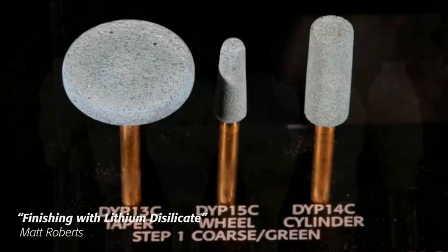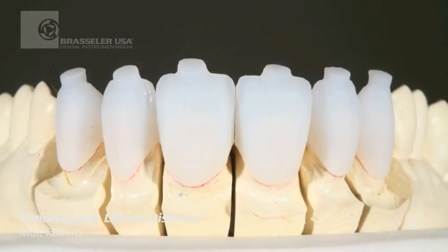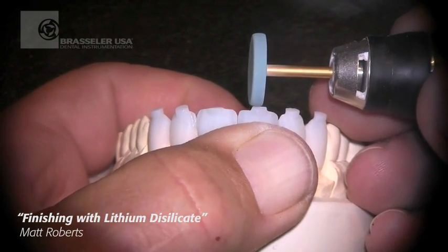For any of you that have ever had to finish lithium disilicate, you know that grinding on this material can be very difficult. I'm very excited about a new series of diamond impregnated rubber instruments from Brassler, designed specifically for finishing either lithium disilicate or zirconia. As you can see when we start looking at this, the green coarse grit takes off sprues very quickly.